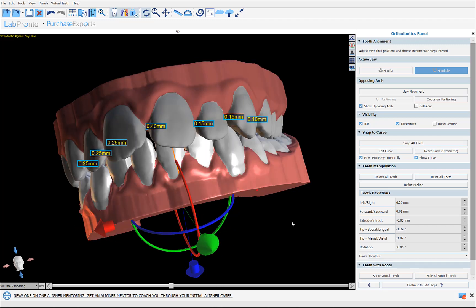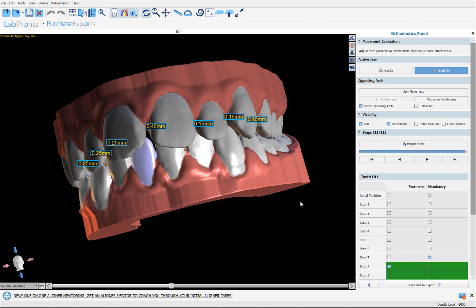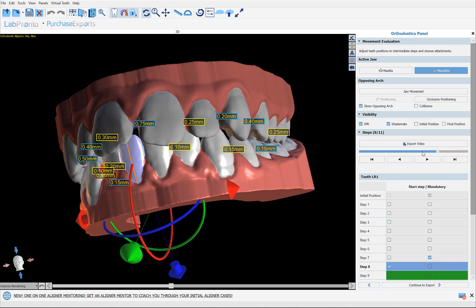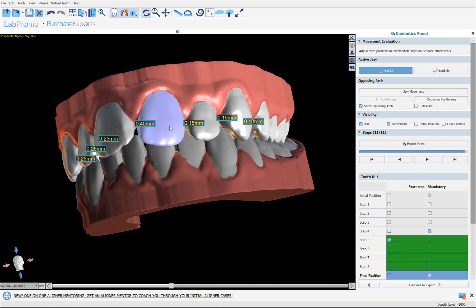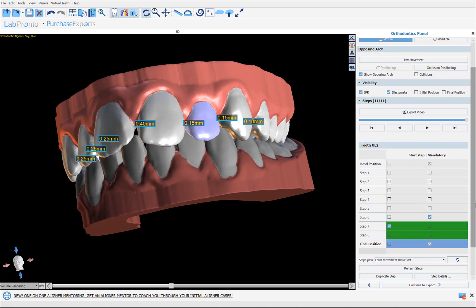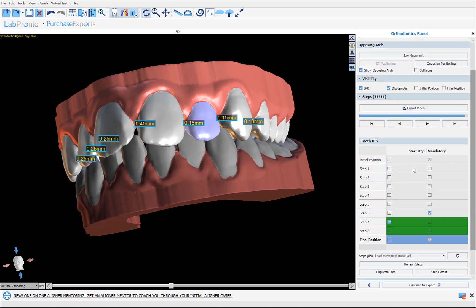Continuing with the process flow, I'm going to leave the setup as is and click Continue to Edit Steps. Here we can see the slider showing teeth movements on each step. We've added visualization of green when a tooth is actually moving — if you click on a particular tooth, the steps for which that tooth is moving will be highlighted in green. The control panel gives us the ability to create modifications of how the teeth should move and in what sequence. If you're satisfied with the software's suggested steps, you can just click Continue to Export.